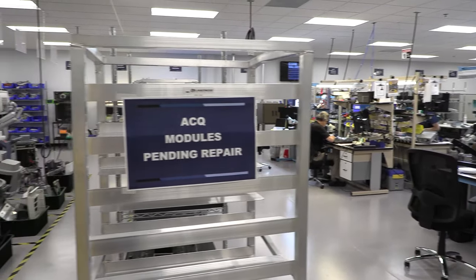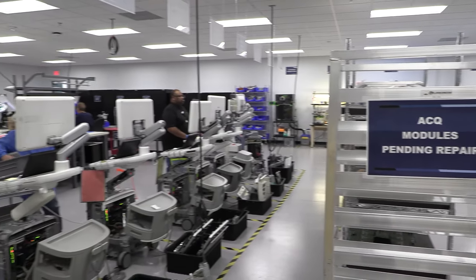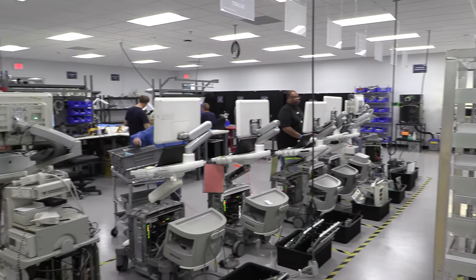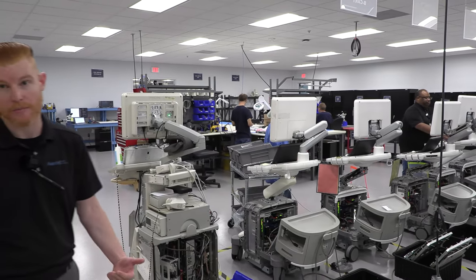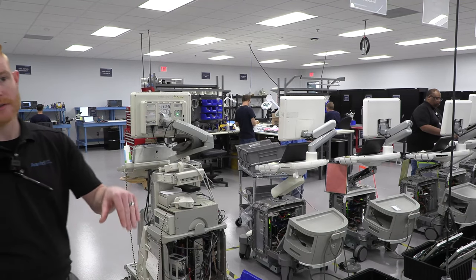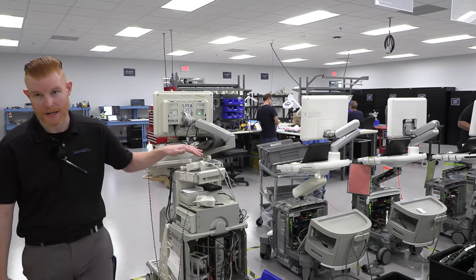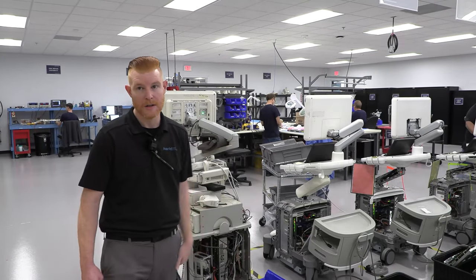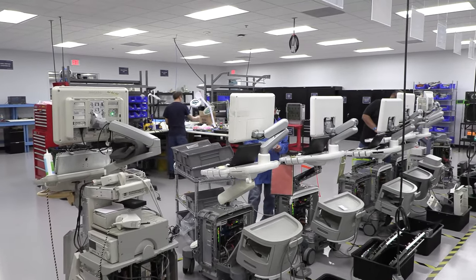So we showed you guys one set of test beds for ultrasound that we invested in, but now you're going to see another set here. Basically these are set up literally just for testing the boards that we repair, boards and power supplies. The systems that you saw earlier are here just for PCs. These are set up just for doing boards and power supplies and also monitor testing. So we've definitely made a huge investment in the equipment here. Yeah, that's a lot of money in medical equipment.